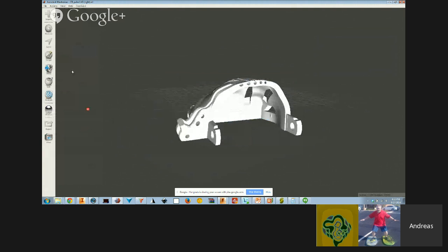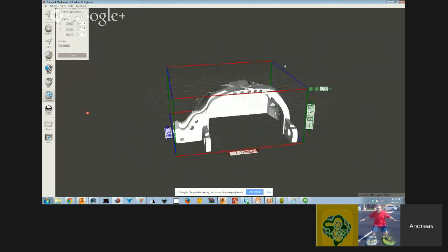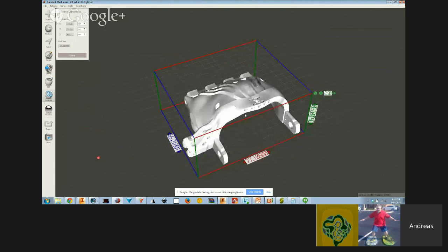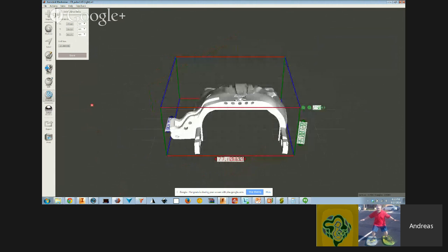And what I can do here is go into the analysis bucket and choose, first, before I do any sort of supports to my object, I just want to check the dimensions because it could be astronomically large and then sort of try and do supports which rely on a real world scale. So you want to just make sure the size of your part is correct, and this looks right? So we have 6 centimeters or so, as expected. Good. You can adjust it in here if you need to, like scale it. You just enter a number here, and then hit enter.